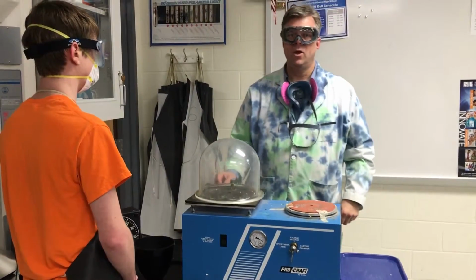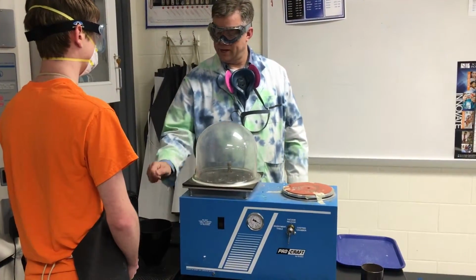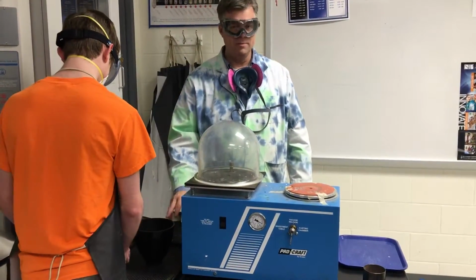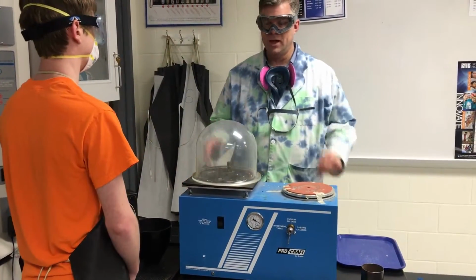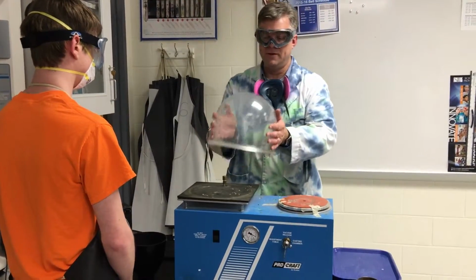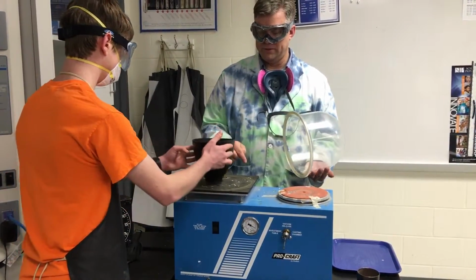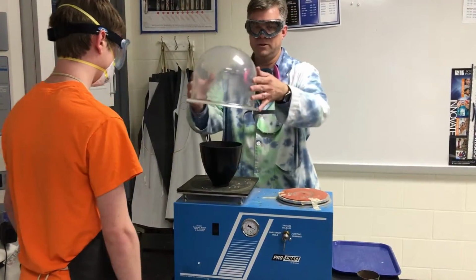Okay, so you've just gone ahead and knocked off your spoon to get all the investment off. Put your spoon down on the tray. It'll be drippy. We're okay. That's why you have it on the tray. Then what you're going to do is lift off the dome, put your investment in here on the investment table, and we're going to put the dome back in.